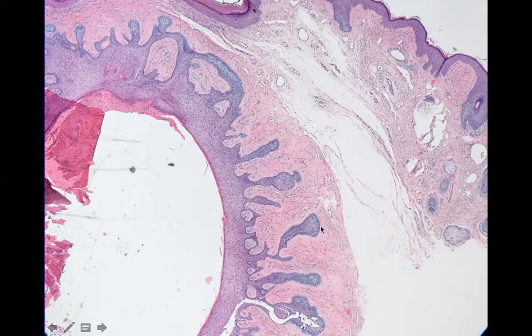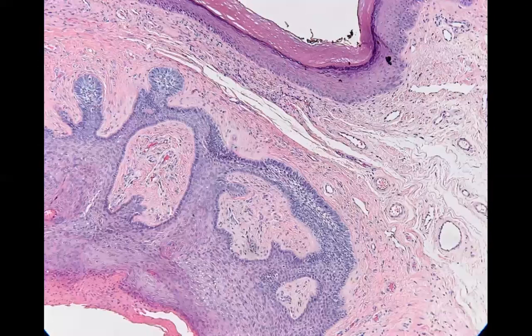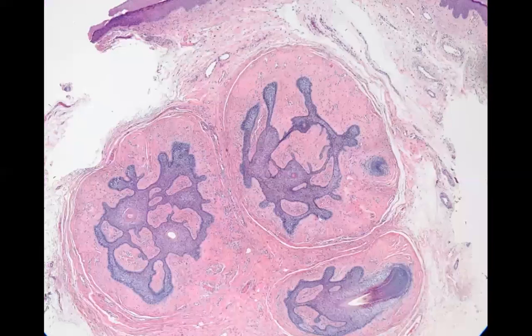You can see that you've got almost a matrical portion of a hair follicle. Sometimes you'll even see inner and outer root sheath and a little tricholemmal portion. So mama and her babies is what it's been called. See here, it's a little bit more complex. These are palisading basaloid cells. And then you have a little bit of infundibular stuff. Sometimes you'll have a little bit of the pale tricholemmal stuff. So it's more complex than the hamartomas.